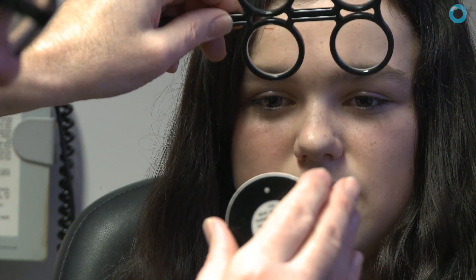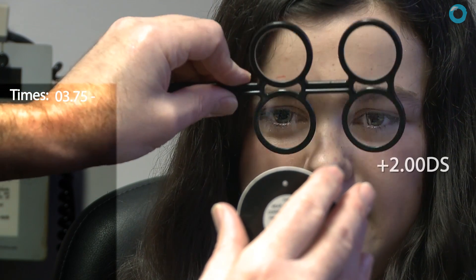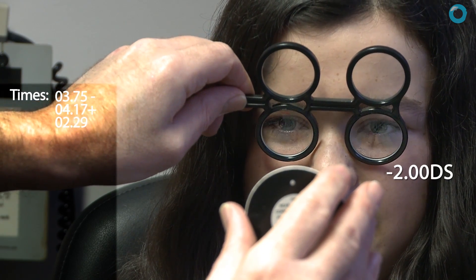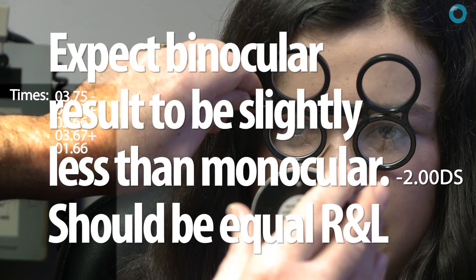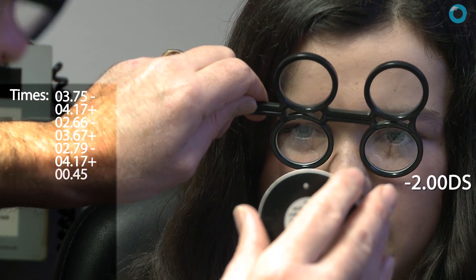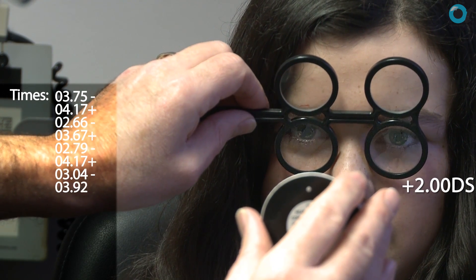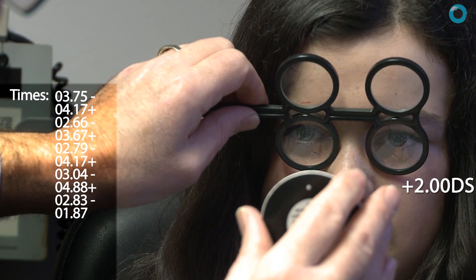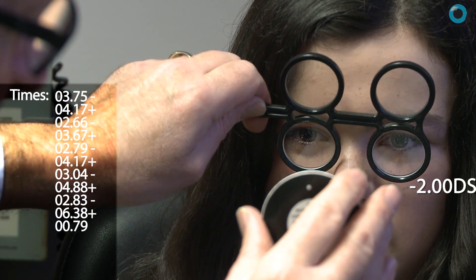This is then repeated with both eyes working together. Remember, when asking the patient to stimulate two diopters of accommodation, they will also have to converge due to accommodative convergence, making binocular flipper testing much more complicated. The patient must then pull their eyes back outwards to maintain clear single vision, so results are expected to be slightly less. Importantly, if a patient is cheating — possibly by suppressing, even unintentionally — the binocular results will be at least as quick as the best monocular result, allowing you to compare and understand what's going on.